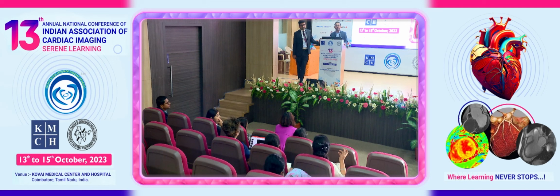It's not solely for the purpose of plaque evaluation, but also in the symptomatic population. As the current guidelines say, you do a CT, but along with your CAD-RADS 2.0 style report, where you grade the stenosis and grade the plaque, you also provide a quantitative metric saying this is the total percentage of plaque volume, this is the breakdown, this is how much non-calcified plaque there is. So any data wherein you could correlate the quantification of the plaque with MACE would justify doing plaque follow-up also, at least.